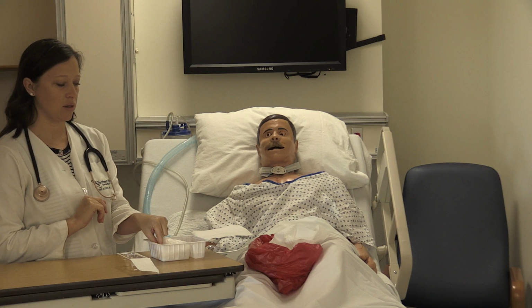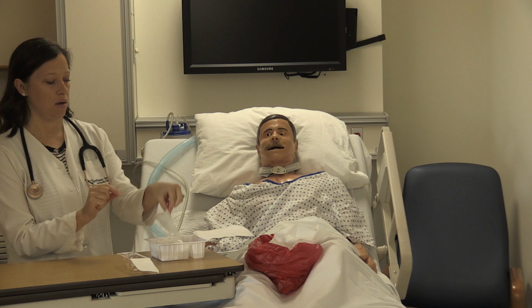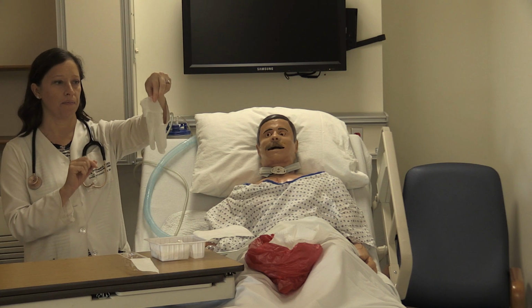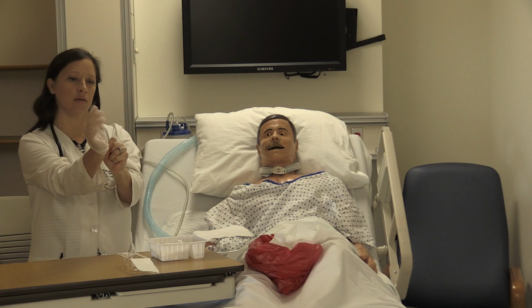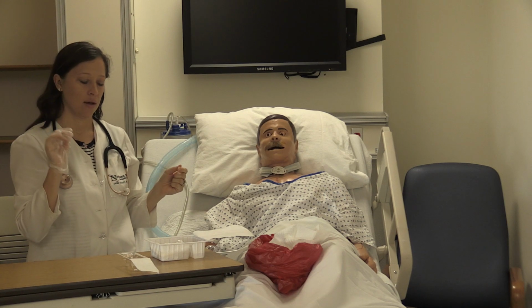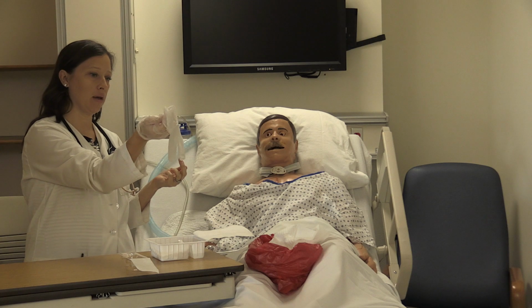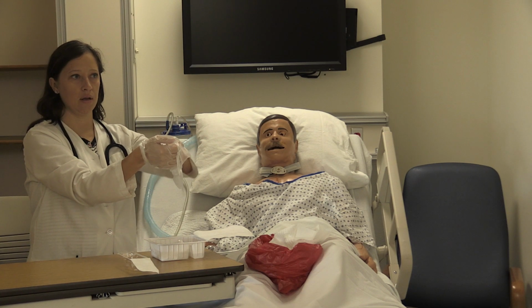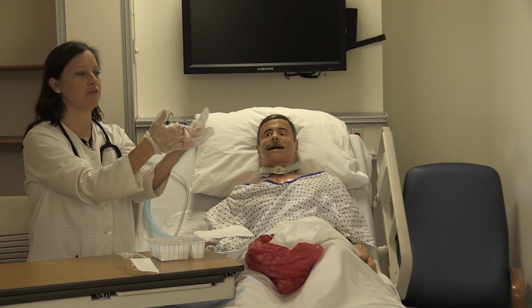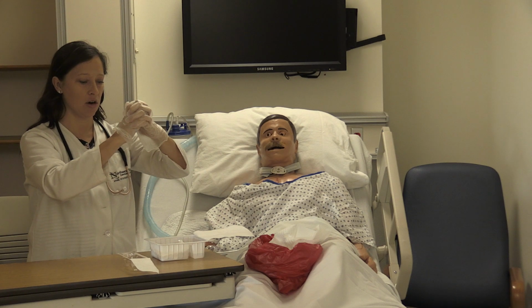So you're going to pick the gloves up, pick it up and step back and apply the glove. Come back up, figure out how you need to get the other glove out, pick it right up. Like I said, the gloves in these containers are a little bit, they're not nicely folded, so you kind of have to figure out where your thumb is. So now you have your sterile gloves on.